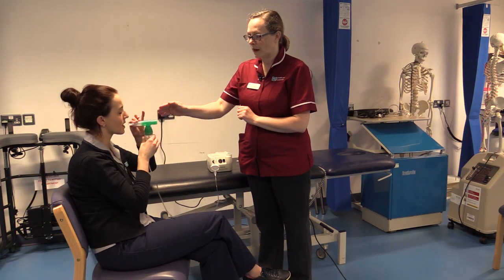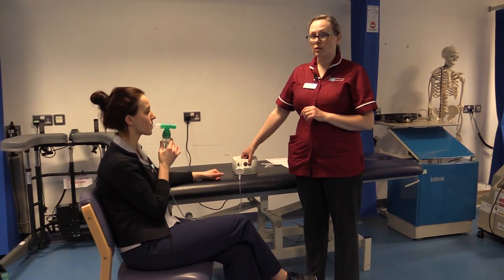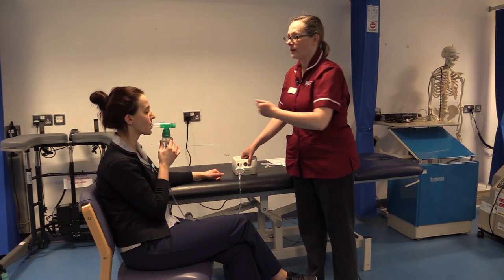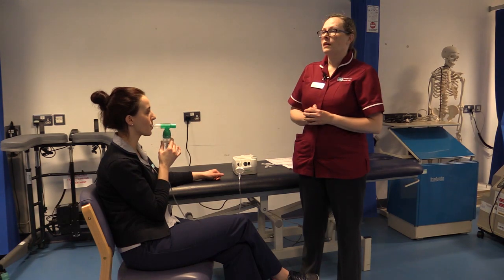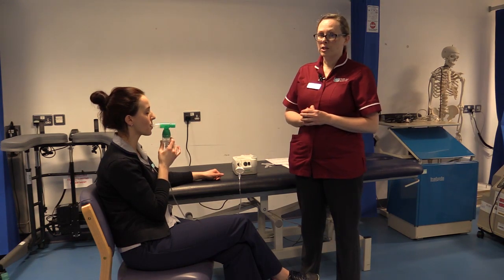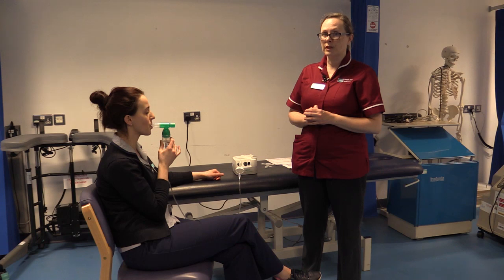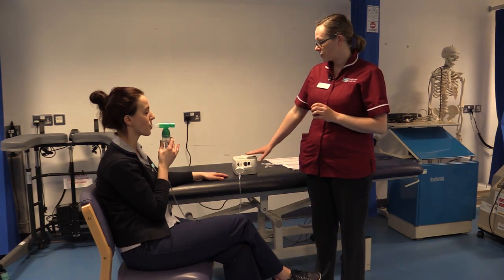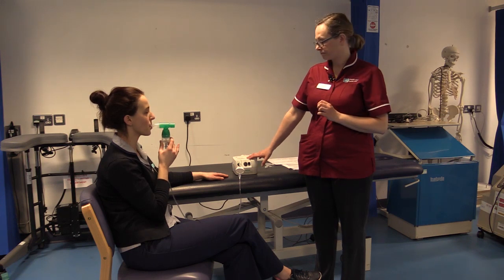Some patients will have a mask attached, but most will have a mouthpiece. When you turn the machine on, you will see mist coming from the other end. I would strongly advise, if your patient is suspected or confirmed coronavirus 19, that you do not stay in the room while they're using their nebuliser. Ask your patient to turn the machine on themselves once you leave the room and ask them to turn it off before you return to the room.